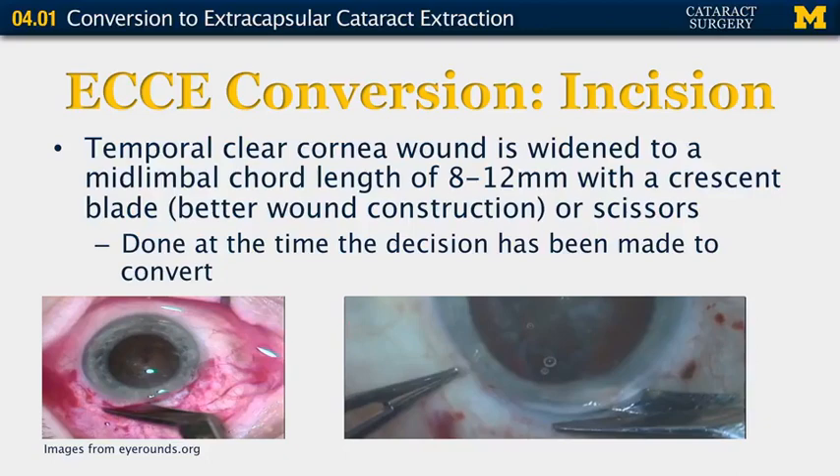If you are not planning this extracapsular cataract extraction but actually converting, you're going to need to make some changes to the incision. Most phacoemulsifications now use temporal clear corneal incisions, so you'll need to widen your clear corneal incision to a mid-limbal cord length of 8 to 12 millimeters, just as with a scleral incision. This can be done with a crescent blade for better wound construction, or with scissors if things need to happen more quickly, at the time the decision has been made to convert.